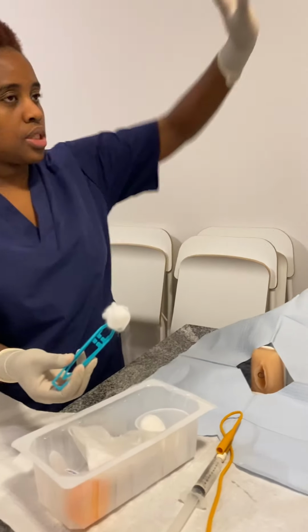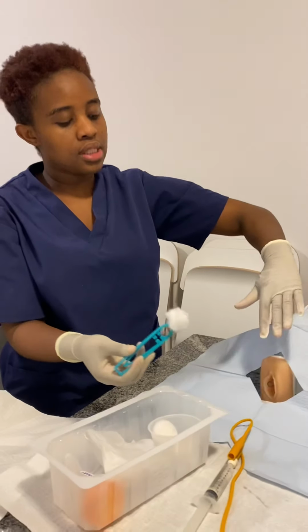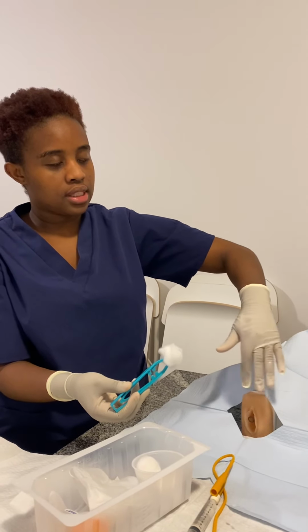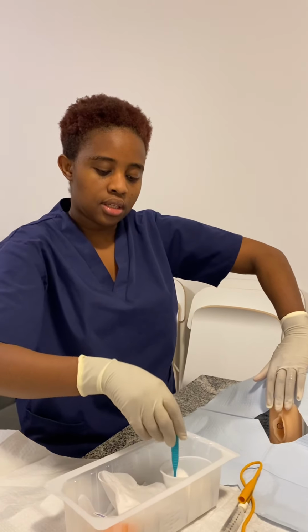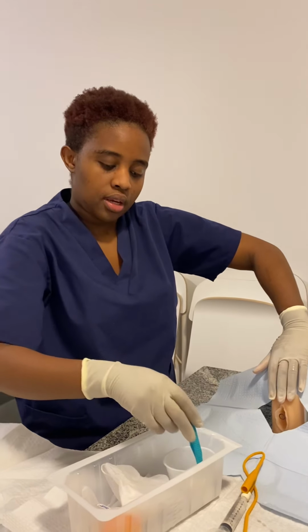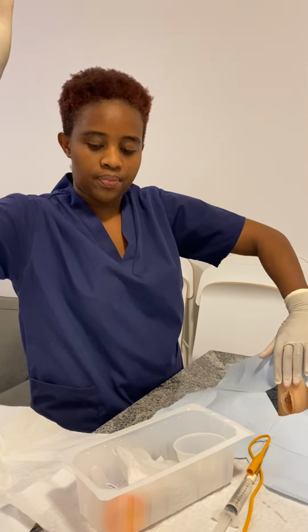I'm going to use my non-dominant hand to hold the area, and once my hand has touched this area, that means it's contaminated. That means I cannot touch any sterile equipment. So middle, I'm going to dispose of it. Okay, and last one in the middle, and then I have to let it go.